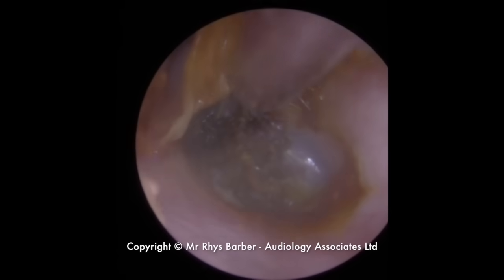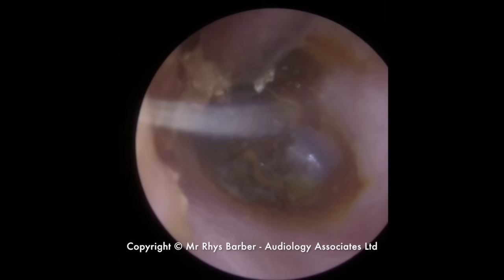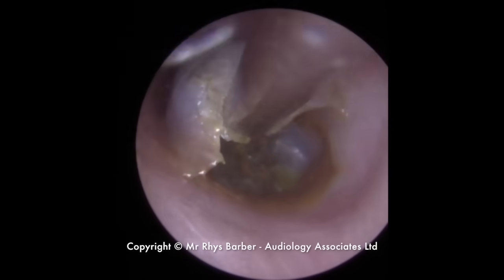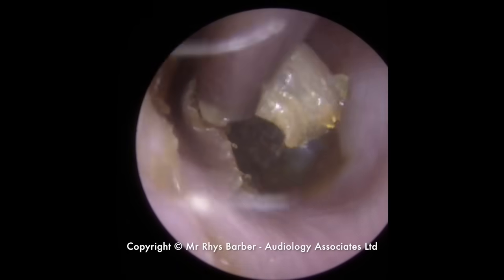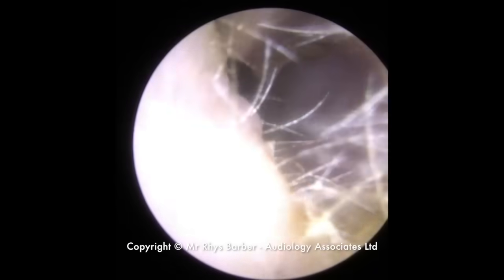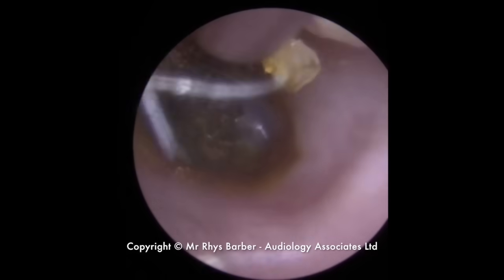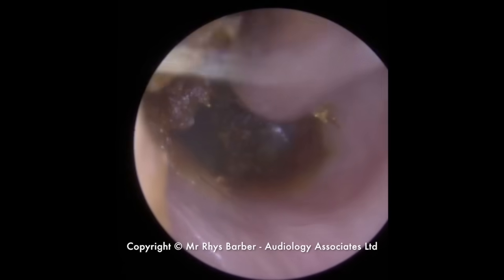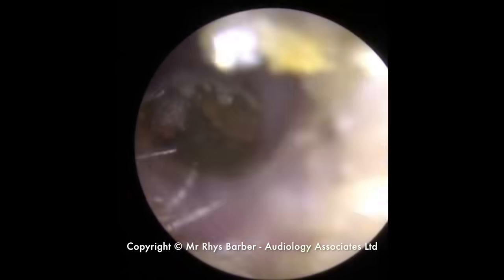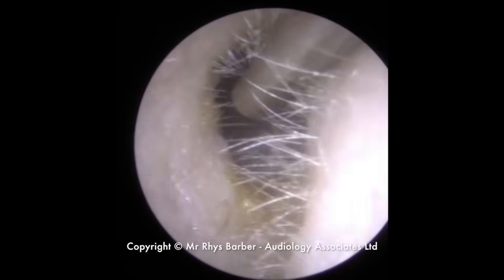We've just found there's a little flap of dead skin. Now this looks like it's all connected to that piece of wax. So when we start pulling on it, you can see it's quite difficult to manoeuvre. But you can see the whole section of wax is just starting to move — it's coming away from the eardrum. So we're going to work on this bit of skin. But as it is, it's breaking away.